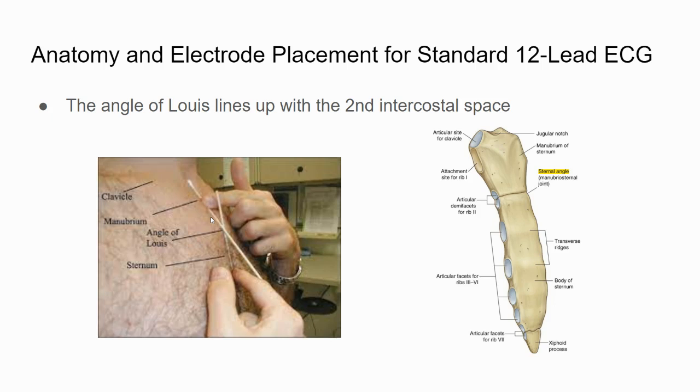It's better to start from the sternal notch, go down to the angle of Louis, move directly to the right, and that'll be your 2nd intercostal space. From there, go over the rib to your 3rd intercostal space, until you feel your fingers sink in again. Then go over another rib, feel a little bump, and your finger sinks in again. That's your 4th intercostal space.